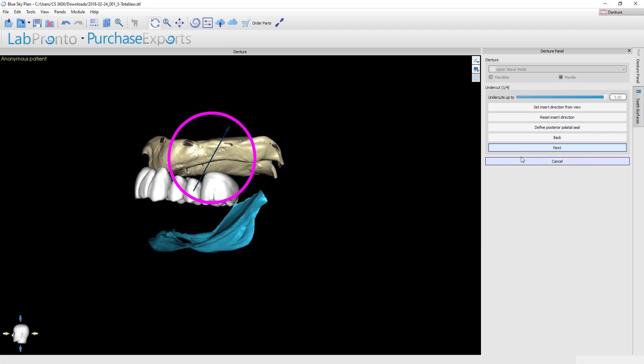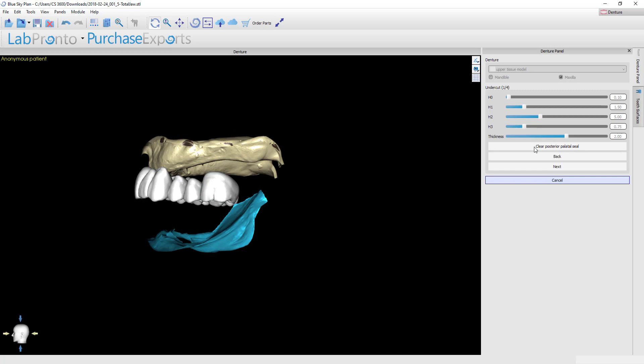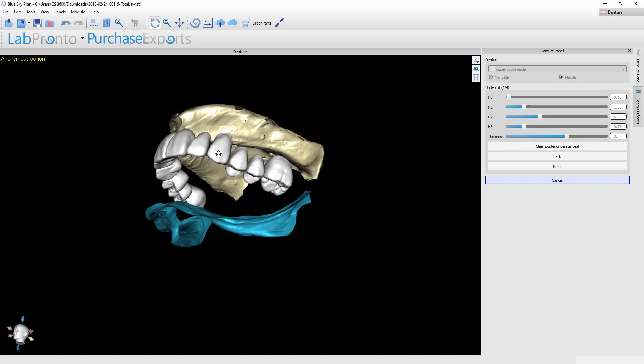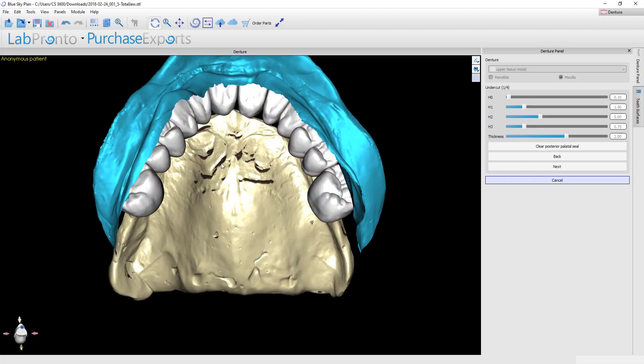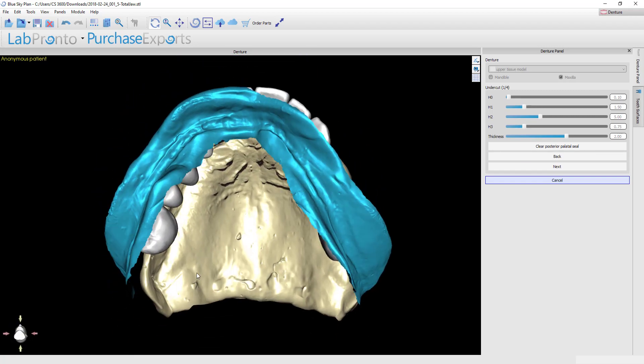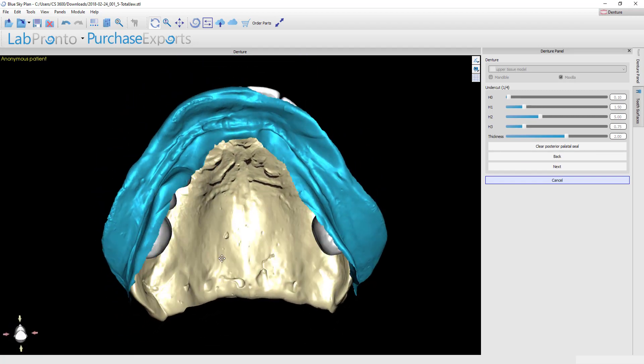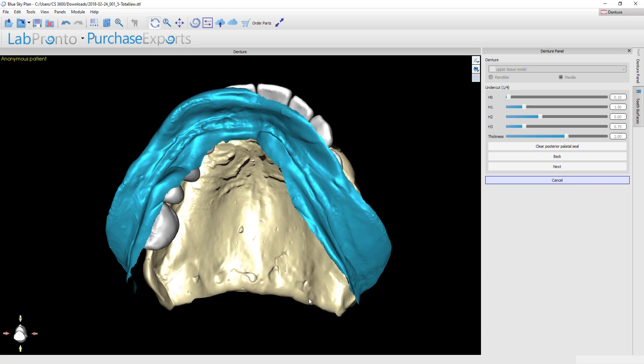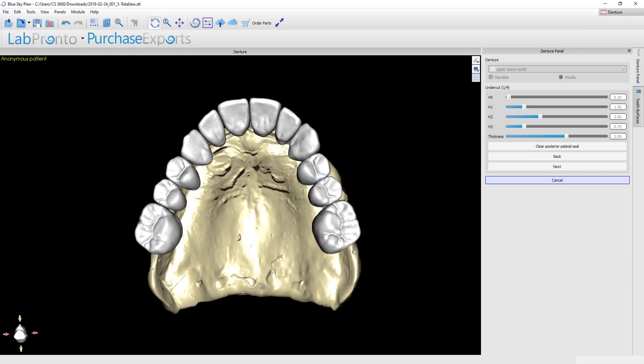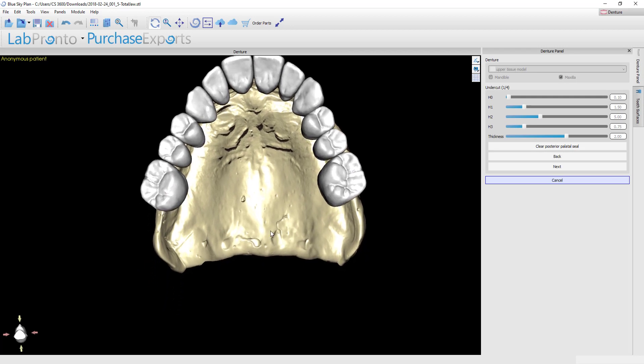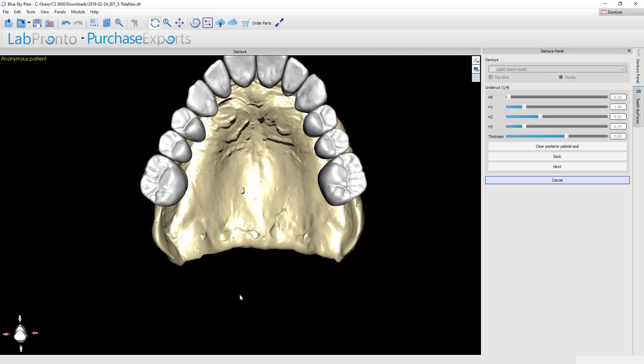Let's now create a posterior palatal seal. This is obviously only going to apply to a maxillary denture. I want to get this mandibular model out of the way, so I can just right-click it, toggle visibility, and you'll see that that disappears. Since this model was generated by just scanning an impression, we obviously don't have a posterior palatal seal and we need to incorporate that.